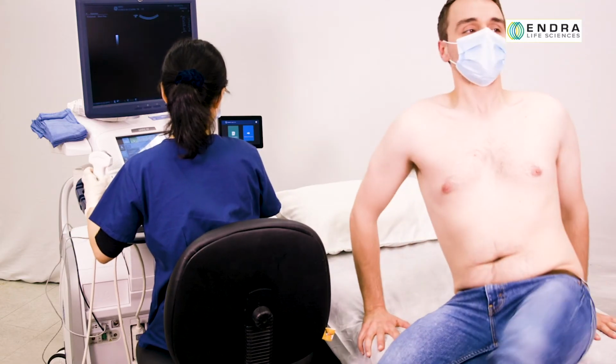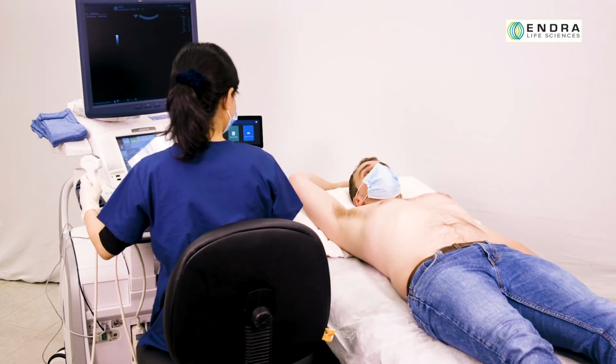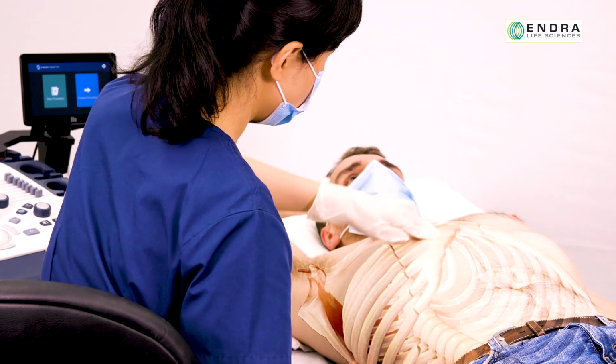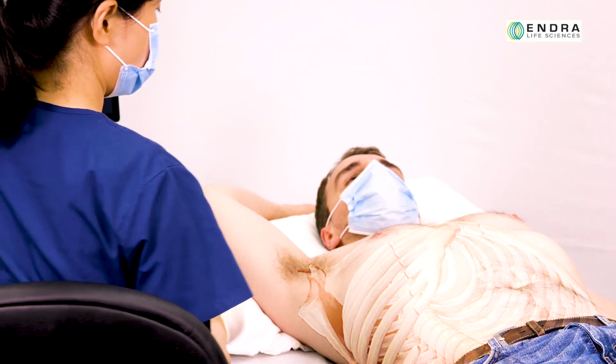Position the patient in a supine position for a right lateral abdominal exam with the right arm over the head. To locate the region for liver fatty tissue assessment, palpate the inferior edge of the xiphoid process, move laterally to the right upper quadrant, and locate the intercostal space.